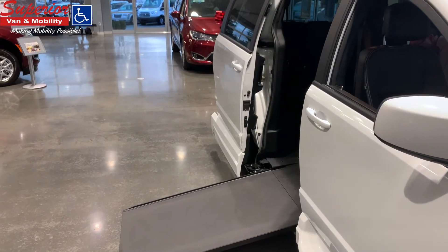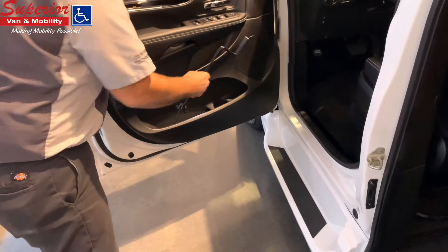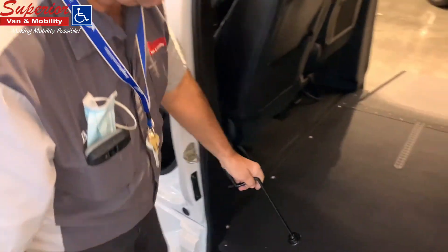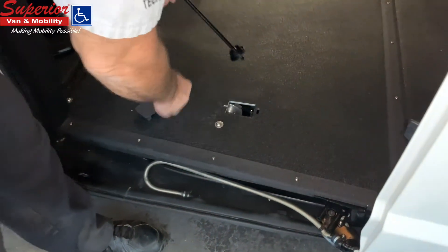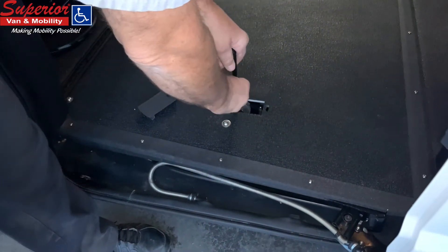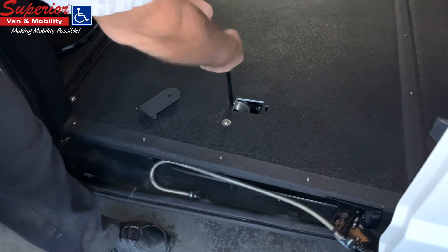In the event that the Sure Deploy system is not working properly, there is a secondary backup system. Locate the hand crank, usually stored in the driver or side sliding door pocket or in the glove box. Use the tip of the tool to remove the protective cap from the floor.